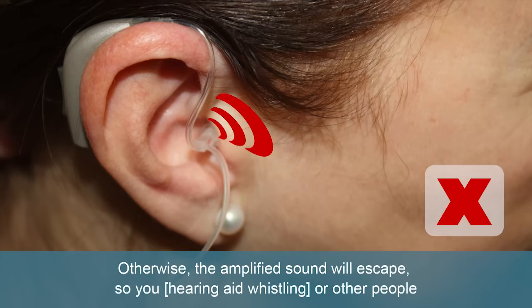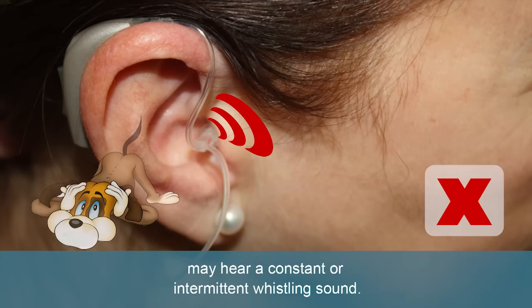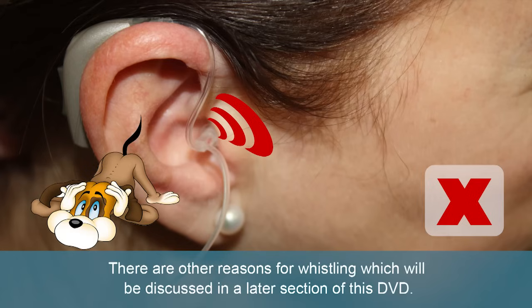Otherwise, the amplified sound will escape, so you or other people may hear a constant or intermittent whistling sound. There are other reasons for whistling which will be discussed in a later section of this DVD.